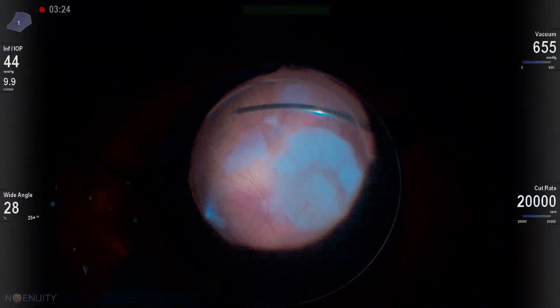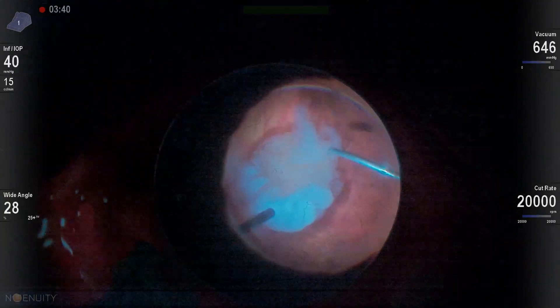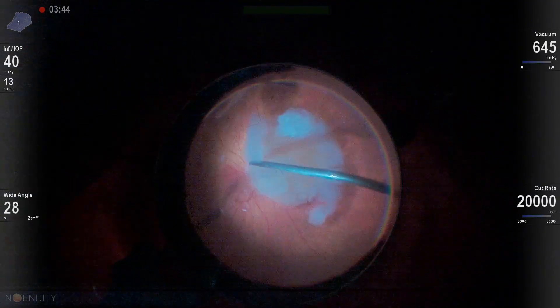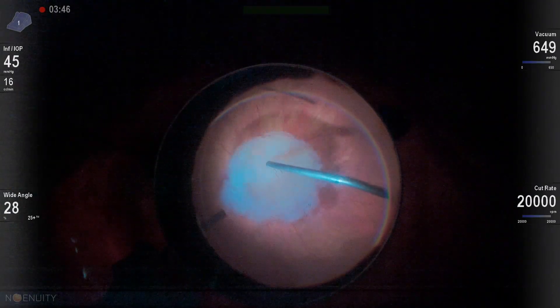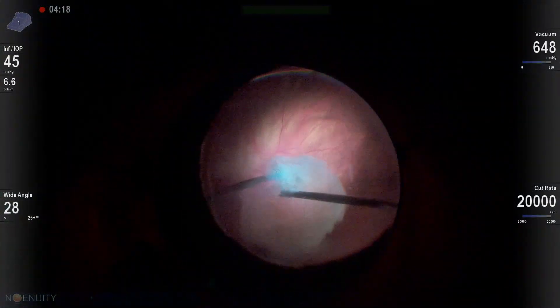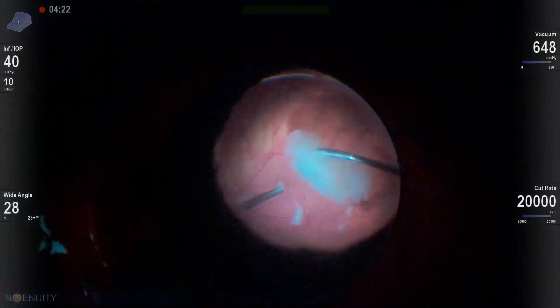We're always going to start out with a vitrectomy. We're going to clear our visual axis behind the lens, remove any peripheral cortical material while making sure to avoid disrupting or destabilizing that lens. Then we'll do a core vitrectomy. If there's already a vitreous separation, great. If not, we'll induce a PVD before we get the fragmentome in the eye.